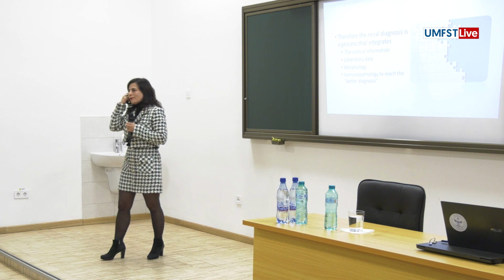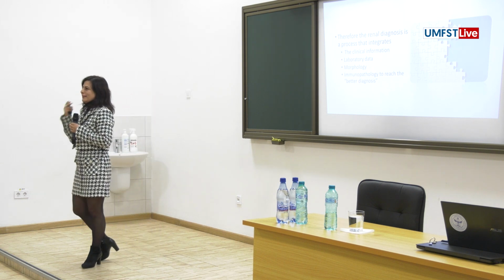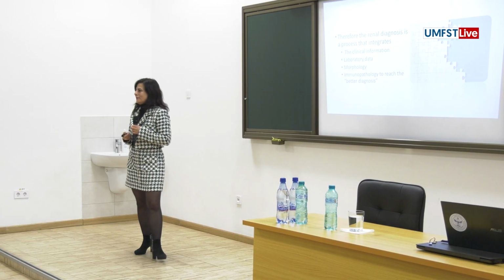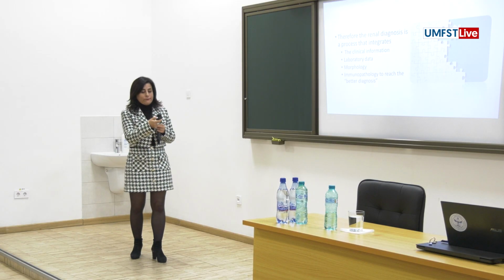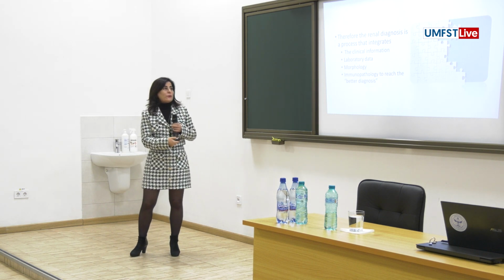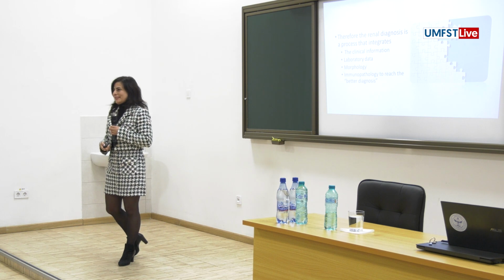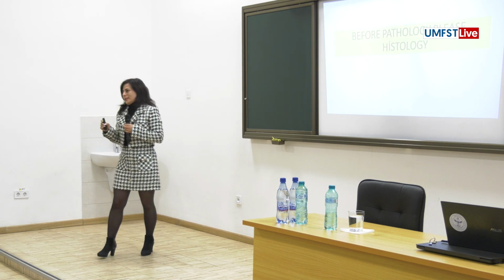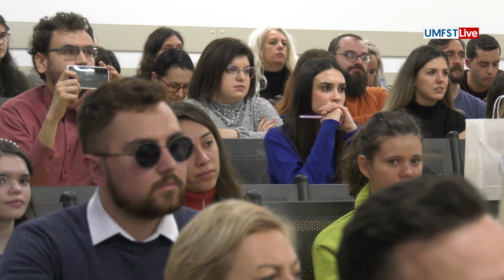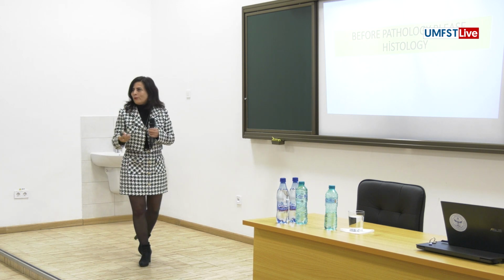Usually I tell my residents, if you like puzzles, because nephrologists are real puzzle lovers, because we have to integrate many things while we are evaluating kidney biopsies: the clinical information, laboratory data, morphology, immunopathology to reach the better diagnosis. Before pathology, we have to talk about histology. We have to know where we are looking, according to the pre-diagnosis, where we should look.